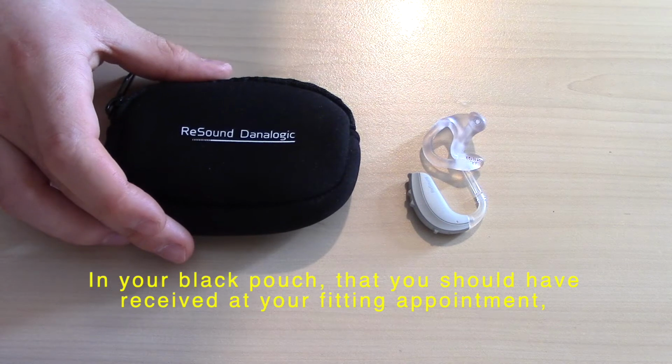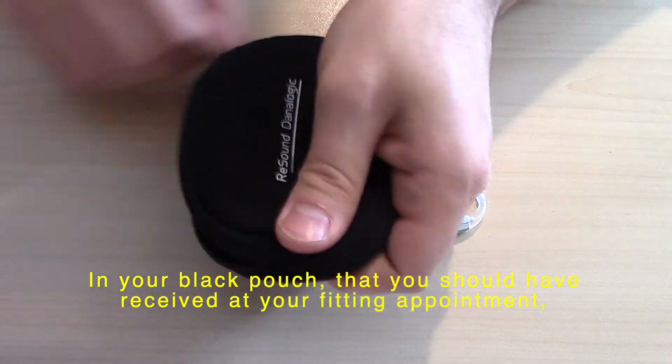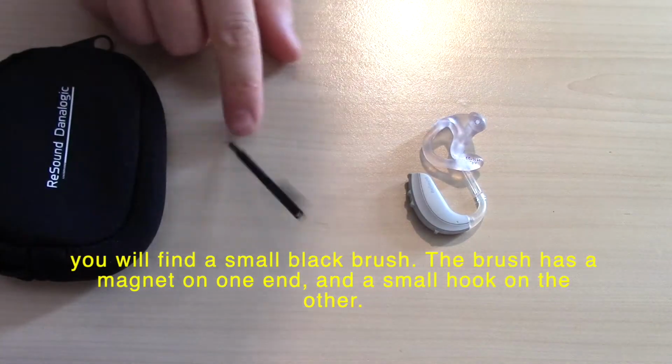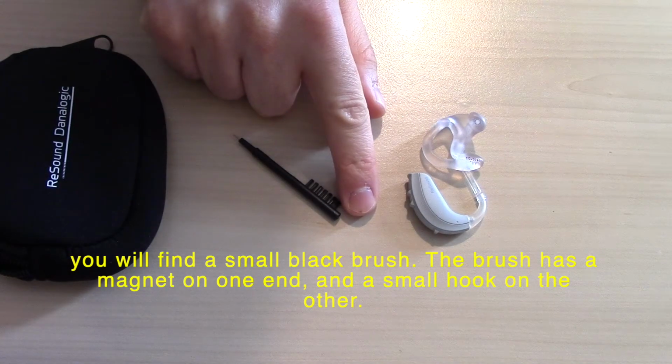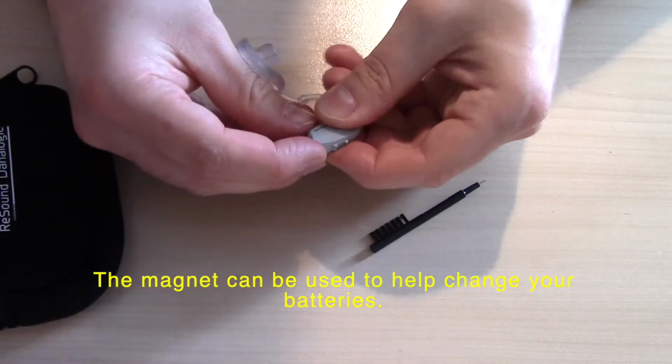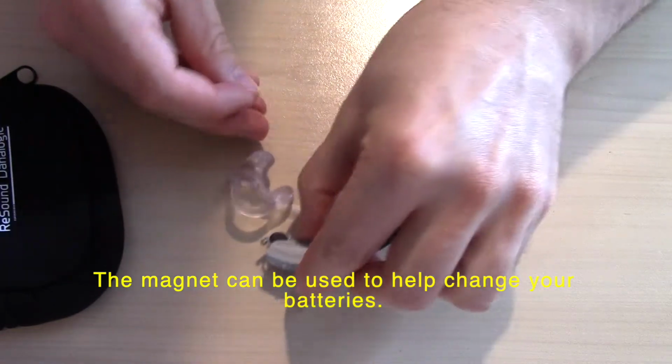In your black pouch that you should have received at your fitting appointment, you will find a small black brush. The brush has a magnet on one end and a small hook on the other. The magnet can be used to help change your batteries.